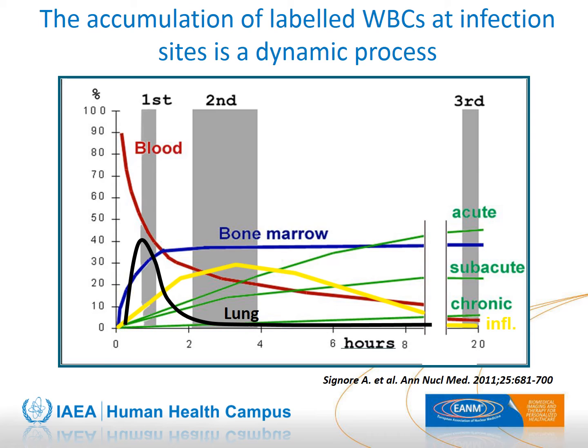Differentiation between an acute, subacute, and chronic infection is rarely possible on WBC scans. However, it is noted that chronic inflammations show the least temporal variation as compared to an acute inflammatory process.